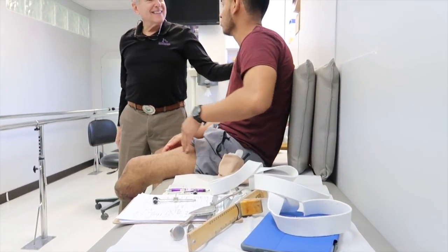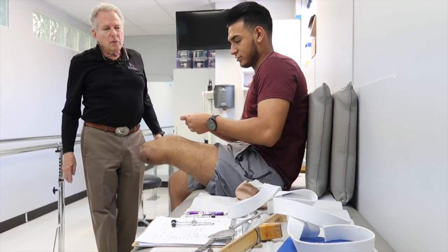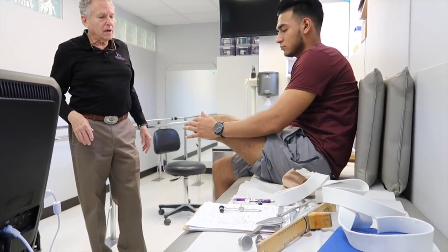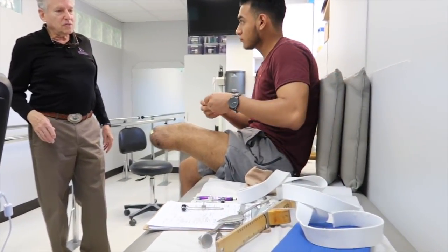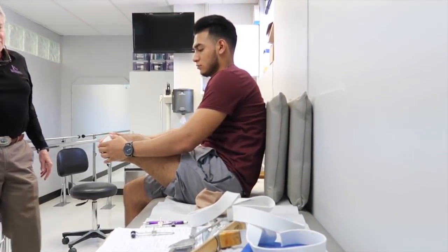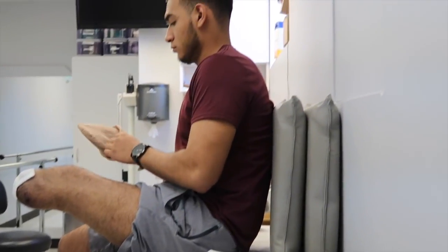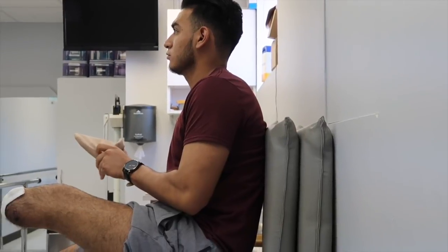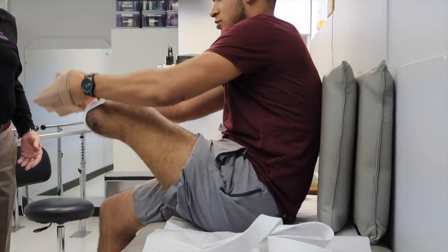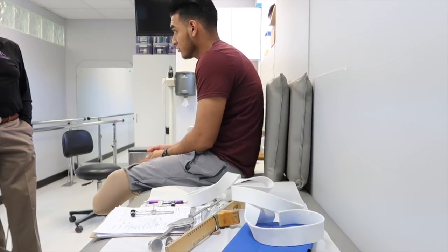How long will I be on the test socket? We'll watch you shrink as the process goes along — you might be in it for a few weeks, maybe a month. It just depends on how your limb changes over time, because if it changes significantly we might want to make a second test socket before we make the definitive one. So there is a possibility of recasting.